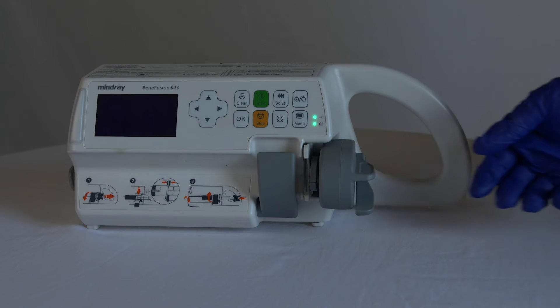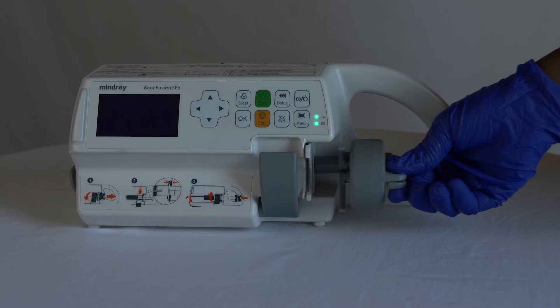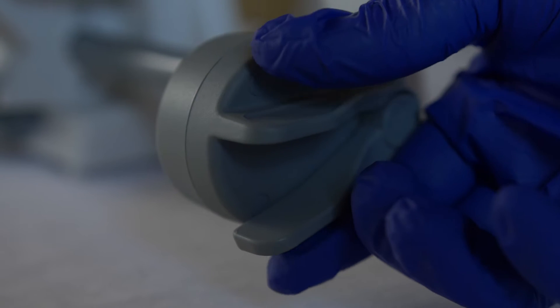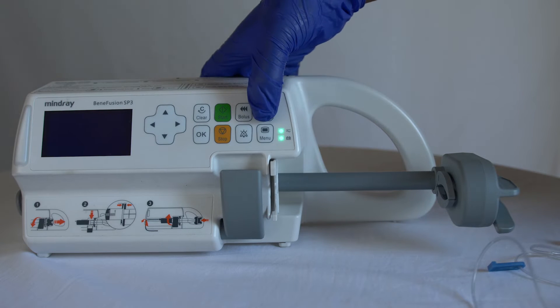To insert the syringe, first open the slider clamp by squeezing the handle. Move the slider gently until it stops, then release the handle. To turn on the device, press the power button.